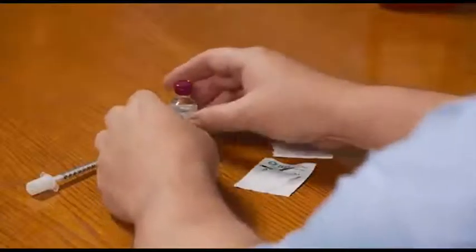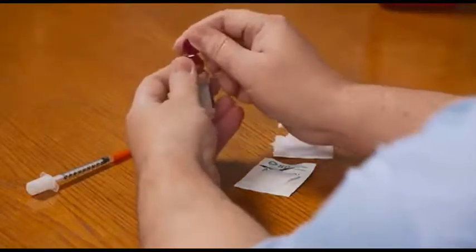Next, let's look at our insulin bottle. If you're using a new bottle of insulin, remove the bottle's plastic cap and throw it away. On the insulin label, write the date you opened the bottle. That way you'll know when a month has gone by and it's time to dispose of the insulin.